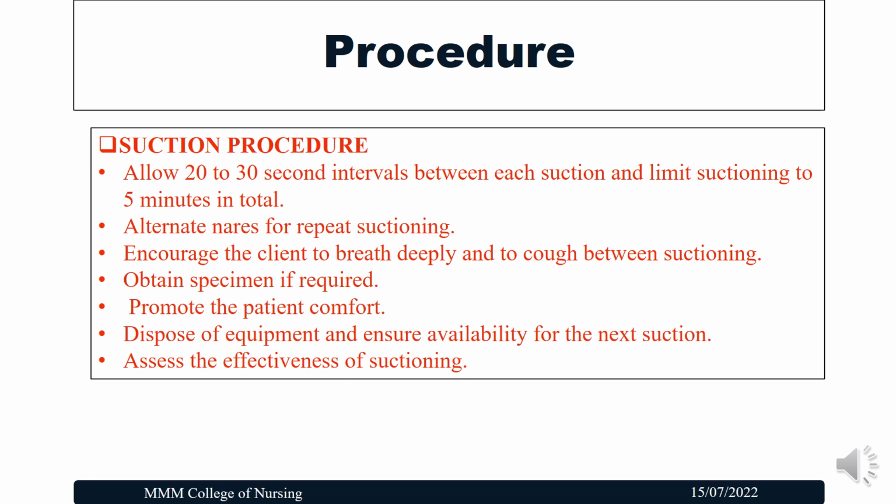During the procedure, allow 20 to 30-second intervals between each suction and limit suctioning to 5 minutes in total. Very often we should not do the suctioning, as it can cause damage to the mucosa. When we are doing nasopharyngeal suctioning, alternate the nares for repeat suctioning. Encourage the client to breathe deeply and to cough between the suctioning.